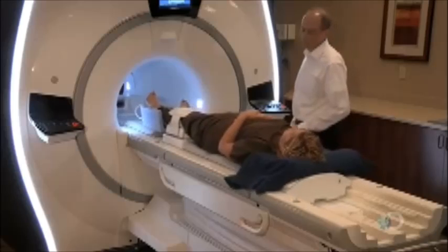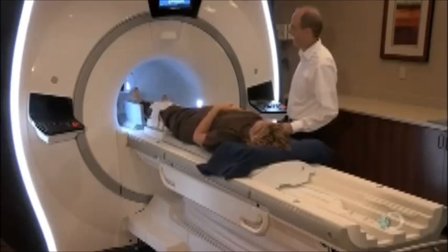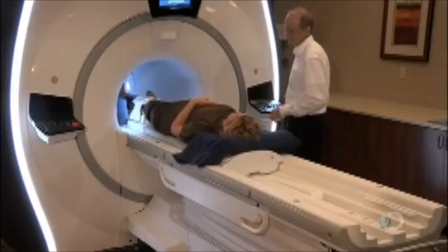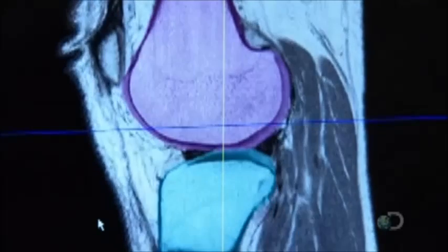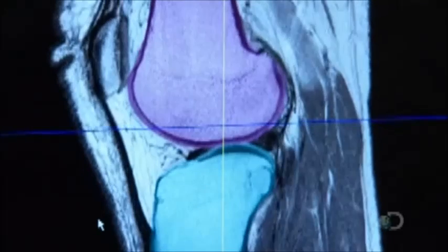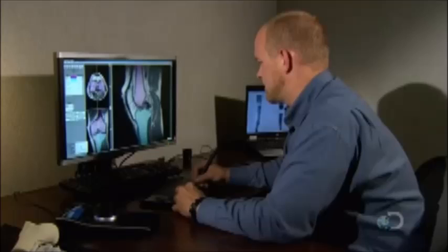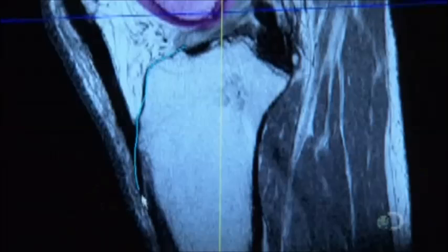Starting with an MRI scan of the patient's knee, this medical device company produces custom-made surgical templates — plastic devices the surgeon uses to sculpt the surface of the patient's bones to align the knee implant accurately. The surgeon no longer has to visually calculate the bone cuts on the spot in the operating room, which takes more time and is more invasive.